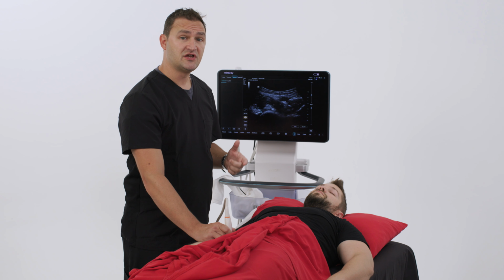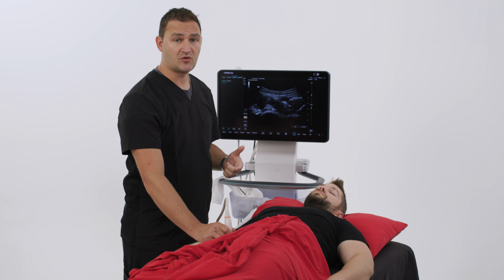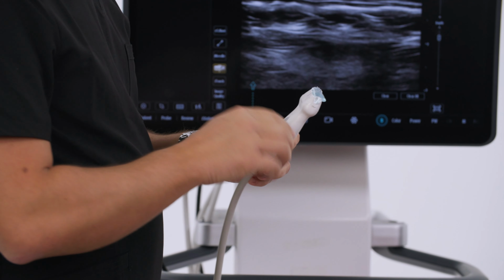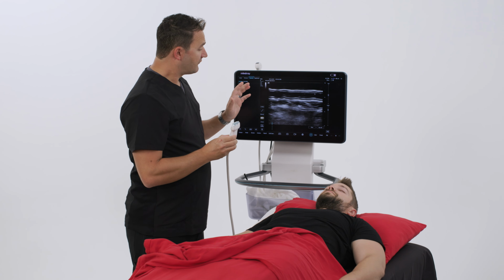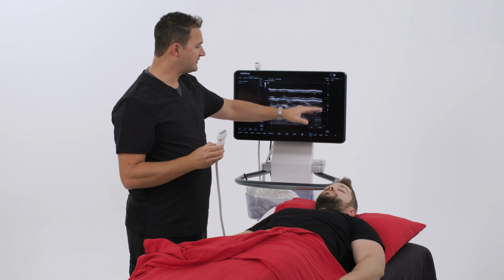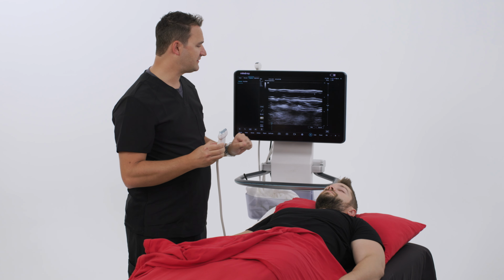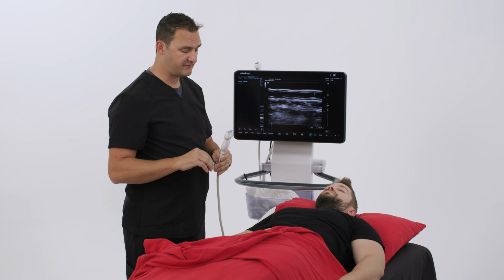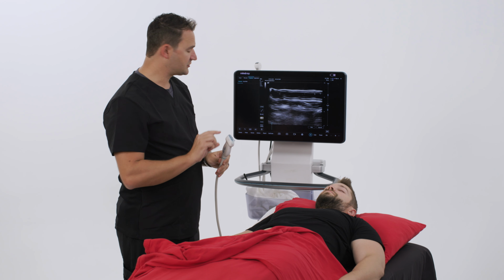Now we're going to move on to the lateral femorocutaneous nerve block, or LFCN. I'm going to use a linear probe. This is a high frequency linear probe. For this block, it is a very superficial block, and because it's very superficial, you can go 2.5 centimeters. I have it at 3 centimeters here, but it's very superficial. You don't need to go very deep at all, even on a larger patient.